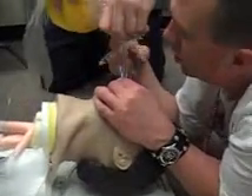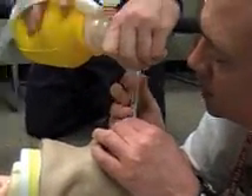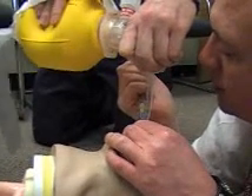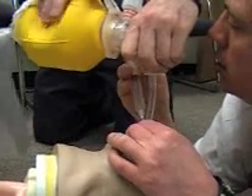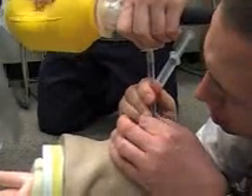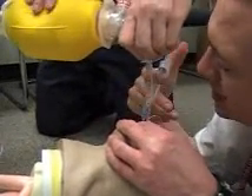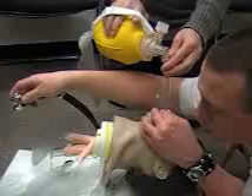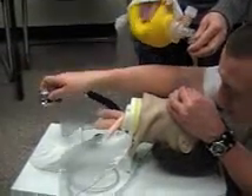I'm going to have my partner continue to oxygenate. I'm going to reattach my syringe and deflate my cuff. I'm going to pull back on the tube, take the tube to 20 at the teeth, reinflate my cuff, and remove the syringe.